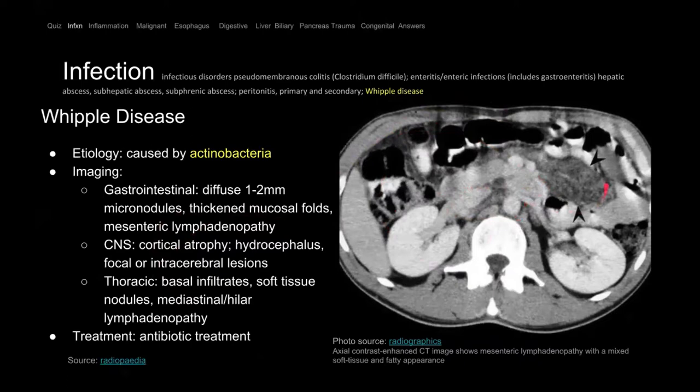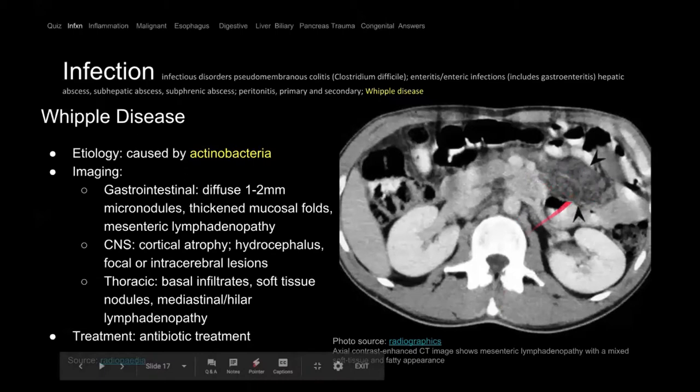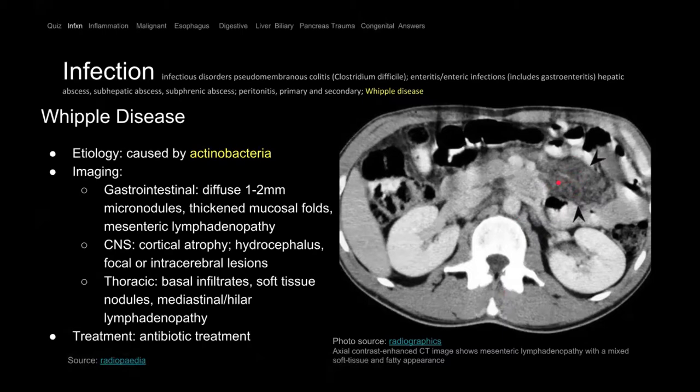Here a patient comes in and the abnormality is an enlarged lymph node. Lymph nodes shouldn't be very large — they should be bean-shaped. Once they become enlarged or round like a ball, you worry about disease. Whipple's disease is caused by the infection Tropheryma whipplei. Patients typically present with remarkable lymphadenopathy that is low density — low density relative to water compared to iso-dense soft tissue. This is Whipple's disease.